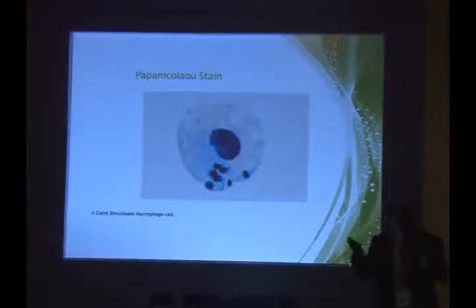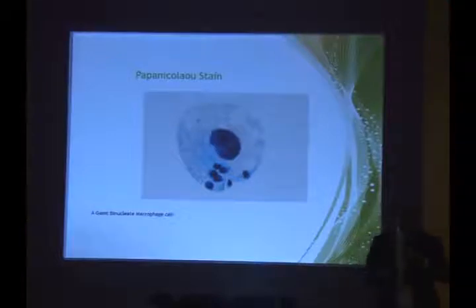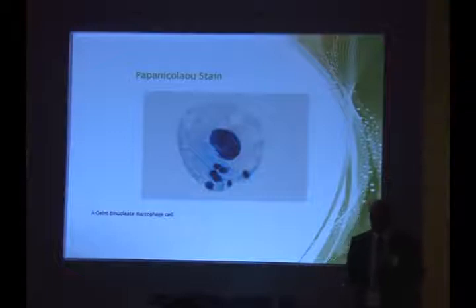First of all, are you able to identify macrophage separately from pus cell in the semen and an immature germ cell? You will have to do a proper Pap stain and spend some time on the slide. But if you are reporting a high number of macrophage cells, all of us know that they come into the picture as a scavenger cell to remove dead sperms. So that means in this patient there are apoptotic sperms which are higher than normal. The sperm death is higher than normal.